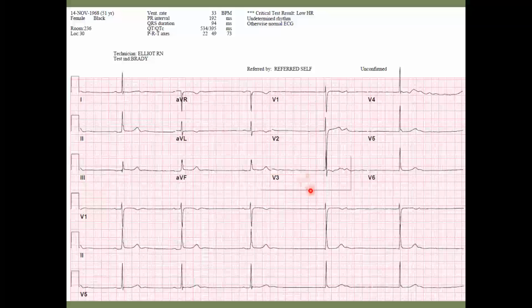All right. So this is kind of an interesting one because when you have a junctional rhythm, you don't always see a P wave. It could be before the QRS, but it could be inverted because it could have been retrograde conducted up, or you might not see it at all because the P wave might be lost in your QRS, or like in this case, where you see it after the rhythm. But this one didn't conduct because the ventricles weren't available for conduction.